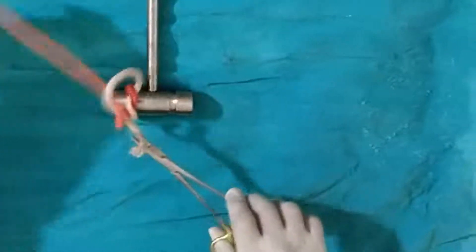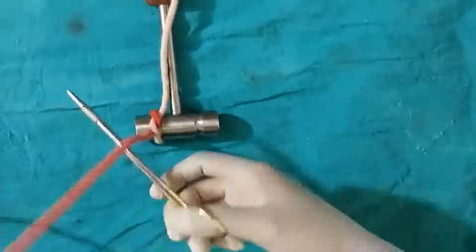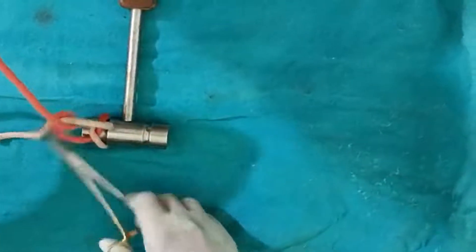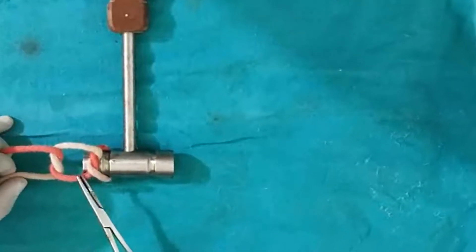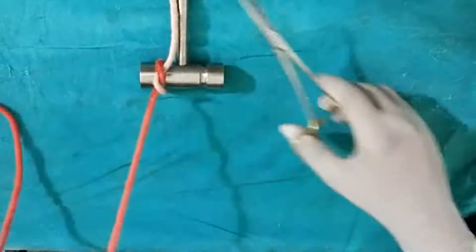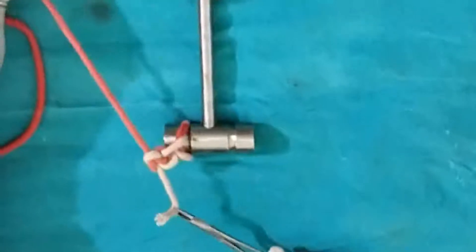Put the needle holder at the inner face and then tie. You can see this is again a square knot. Now I will demonstrate what happens if you keep the needle holder on the outer face — it will result in a granny knot, not a square knot. You can see the throws are crisscross, not parallel. That is why, whenever you apply with the instrument, never use the outer face. Many surgeons commit this mistake. Always hold from the inner face.